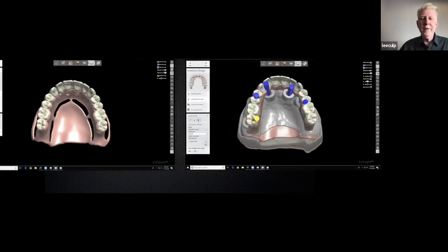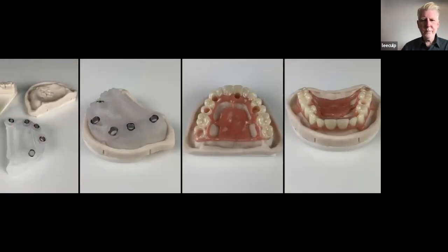So I've got all this information layered up on top of each other. We're going to mill that out and send it to the doctor. And it looks something like that. So the conversion is you still have to attach it, obviously, to the denture. But when it's attached very quickly, you're going to unscrew it, take it out of the mouth, cut 4 or 5 little outriggers off, and it's converted and you're done.